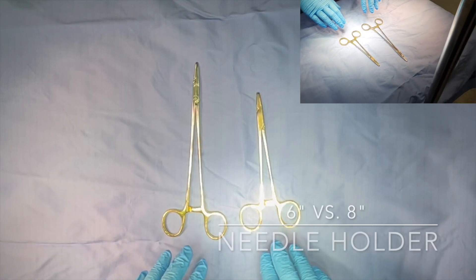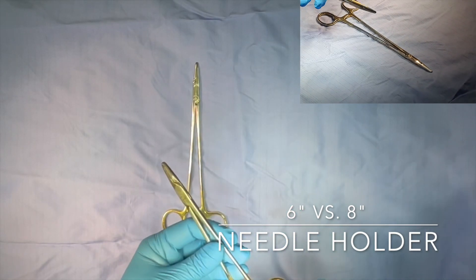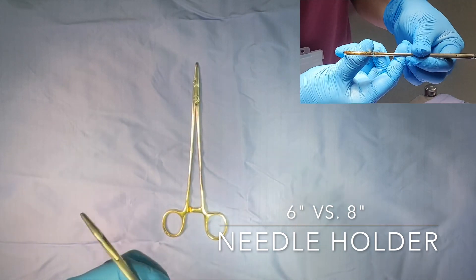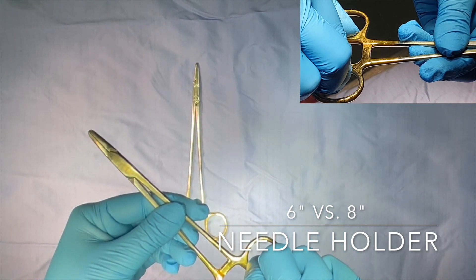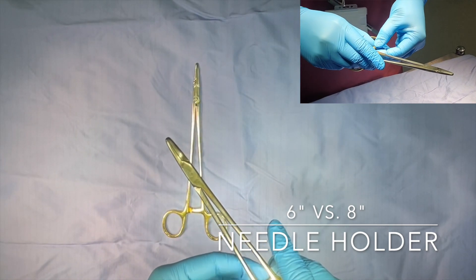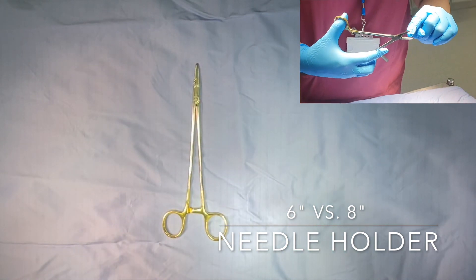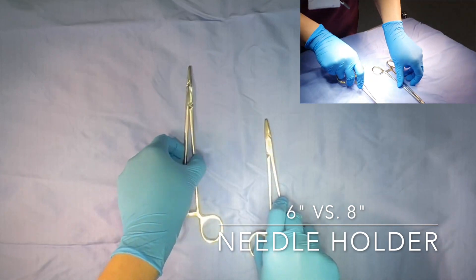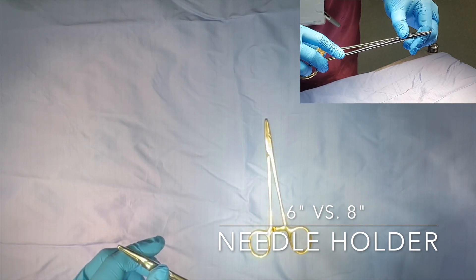Here we have needle holders in different sizes, and their use depends on the depth at which sutures need to be placed. They open and close at the ratchet, which locks in place and ensures the needle does not rotate. The ratchet is locked by pressing the thumb and finger together, and must be released with controlled movements by gently pressing down with the thumb on the ring of the holder. The inner surface has a crosshatch milling pattern which allows the needle to be held securely without slipping. This shorter one would be used for suturing more superficially, whereas the longer one would be used for intra-abdominal suturing.